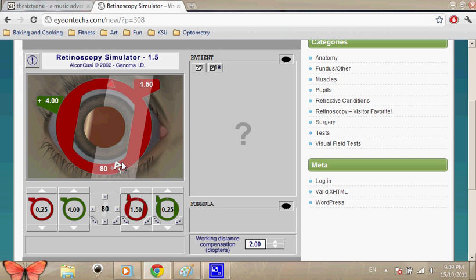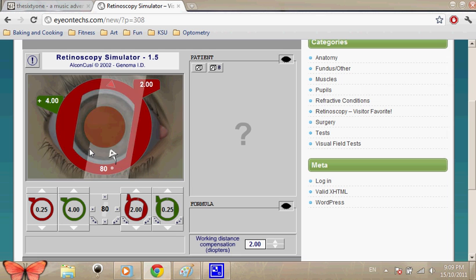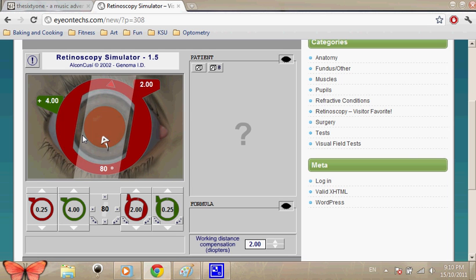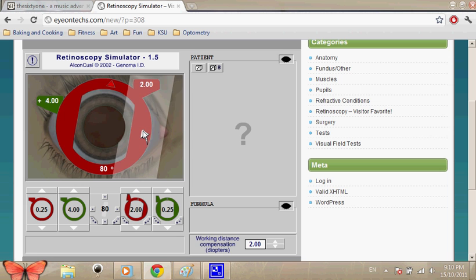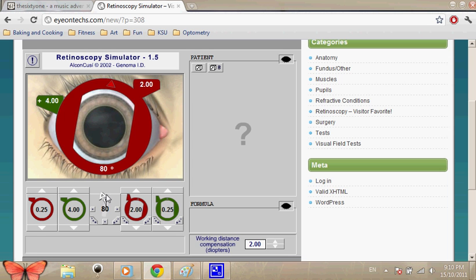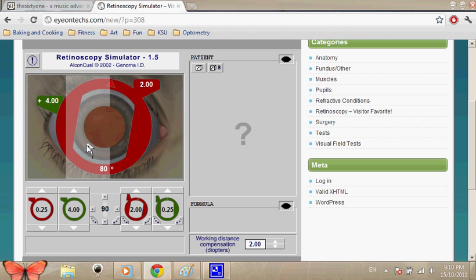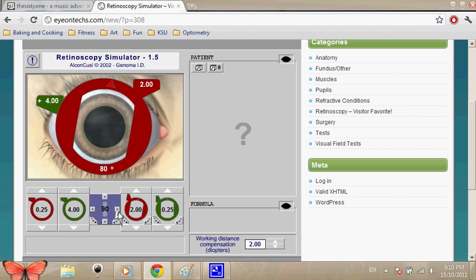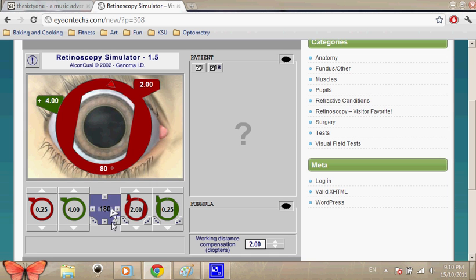If we did get it right, it would mean that we have neutralization in all the meridians. So we have neutralization at 90, we have neutralization at 180. We can have neutralization at any meridian or any axis you've got here.